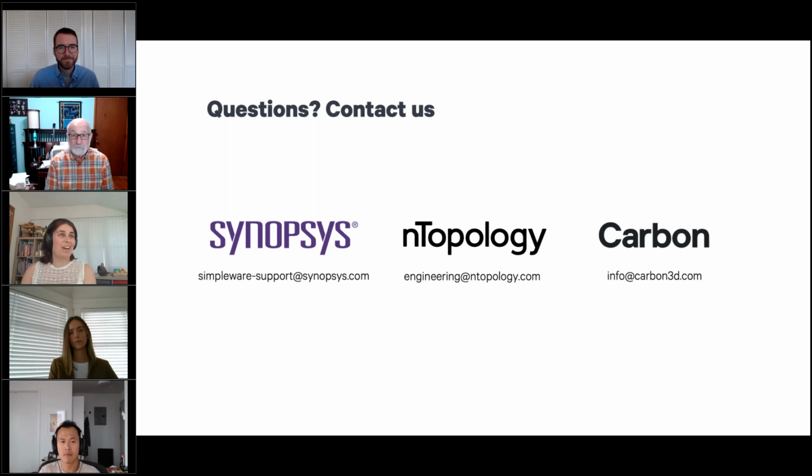I agree with all of you, and the only thing I'd add is speed up. We need to get things moving a lot faster. At Synopsys, we've tackled the biggest challenge that we see, but we need to look at those tricky cases as well as the absolutely routine ones that we can deal with right now. We have the workflow, we've shown it to you, but if we can crack those edge cases and revisions as well, that would be fantastic. This workflow has the power to do that. So I think we have all the components here. Let's just make it happen.